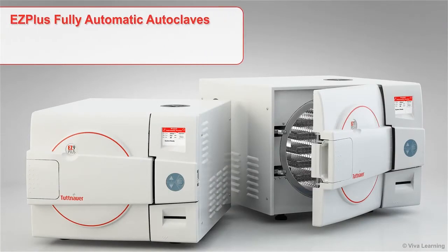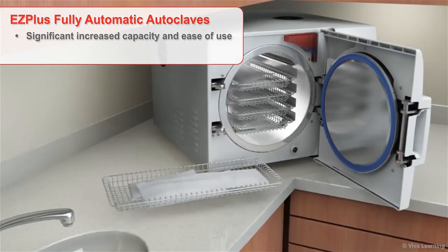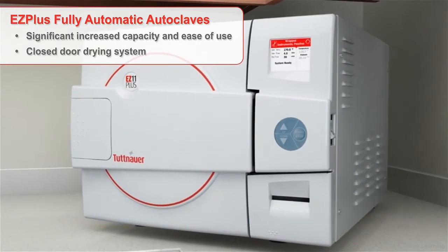The EZ Plus fully automatic autoclaves represent the latest advancements in the office-based discipline of infection control. The EZ Plus is designed to meet the most current sterilization and safety standards while providing significantly increased capacity and ease of use. Plus, the closed-door drying system ensures the door remains closed throughout the dry cycle to maintain sterility and efficient drying of packs and pouches.